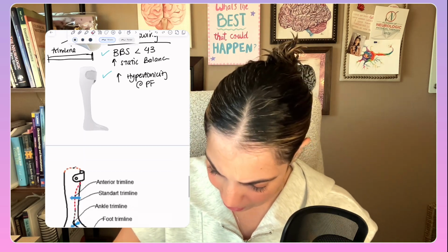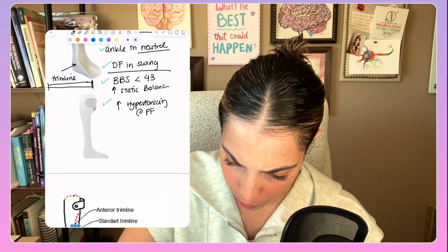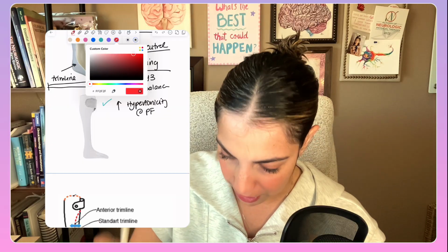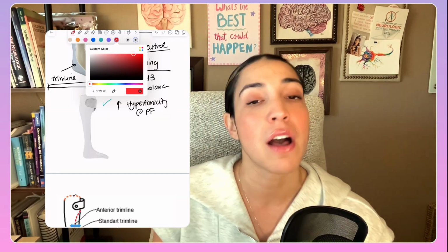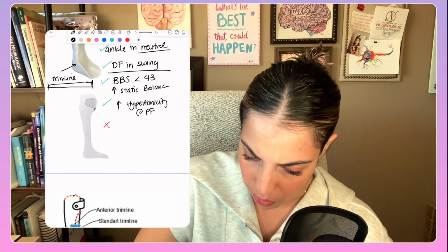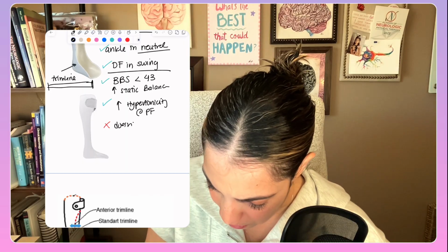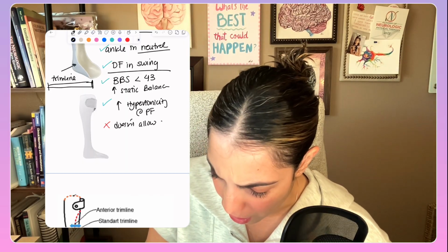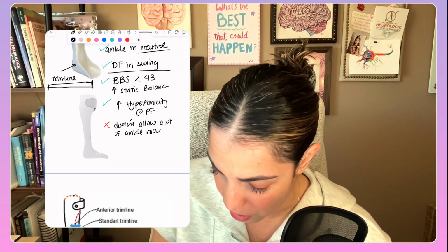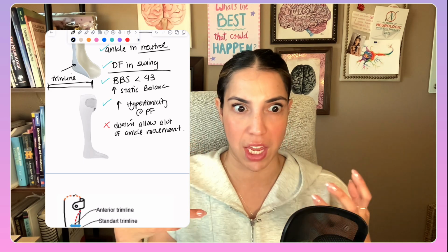So now let me do a red, that way we can really put some dramatic colors. Okay. So cons of the solid AFOs, we're going to put some like that. One is it doesn't allow a lot of ankle movement. Okay, so it's a very thick material.